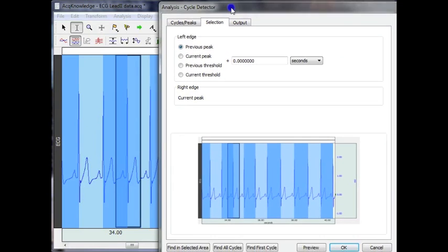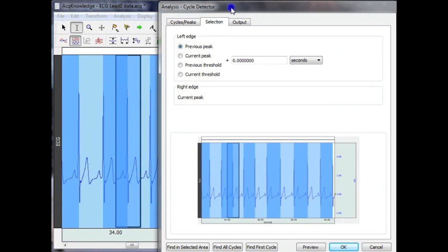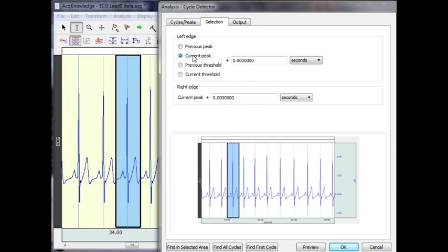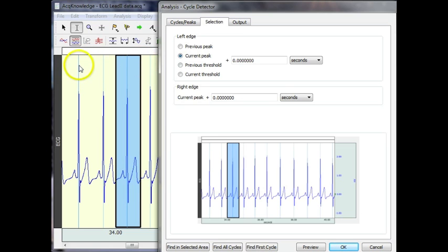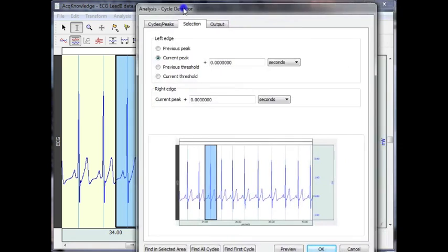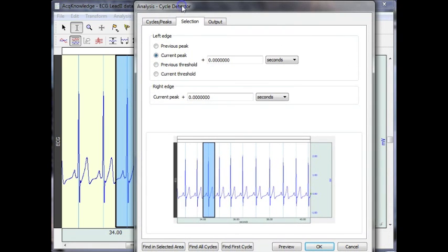And you can see down below, we now have a view of what we're looking at. To simplify things, I'm going to use current peak. And now we've got a faint line appearing over the top of our ECG R wave. And you can see that in the acknowledge graph window and in the view down below here.